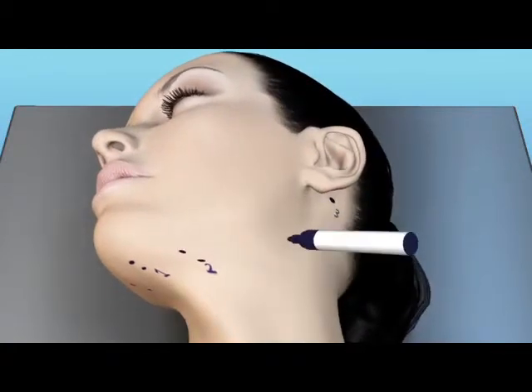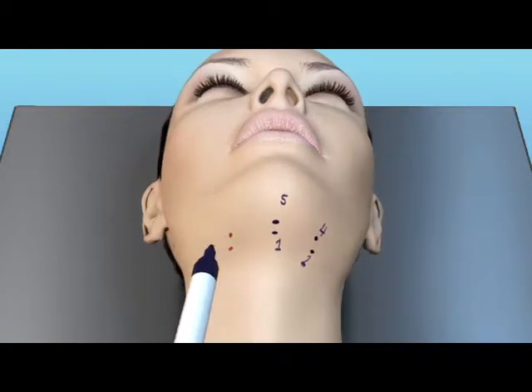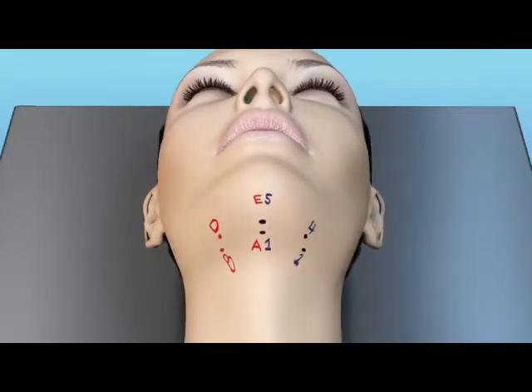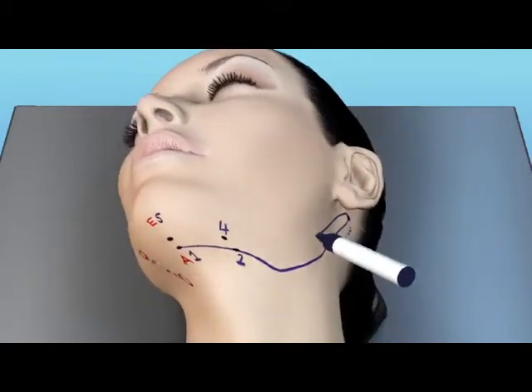The sequencing of 1, 2, 3, 4, and 5 is the left limb of the suture that will be threaded underneath the skin in the subcutaneous space with use of the fiber optic lighted suture rod. The right side is marked with letters, and the threading will sequence from A, B, C, D, E, and out E, where the suture ends will be secured.